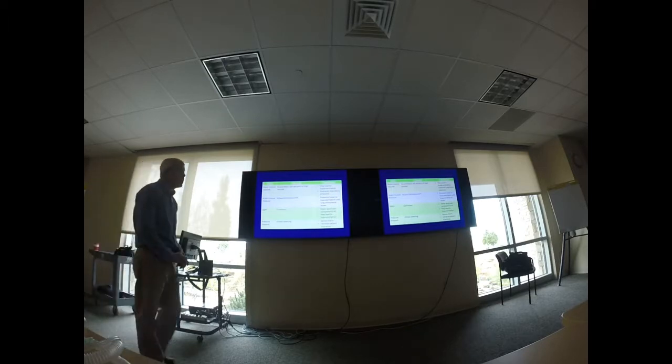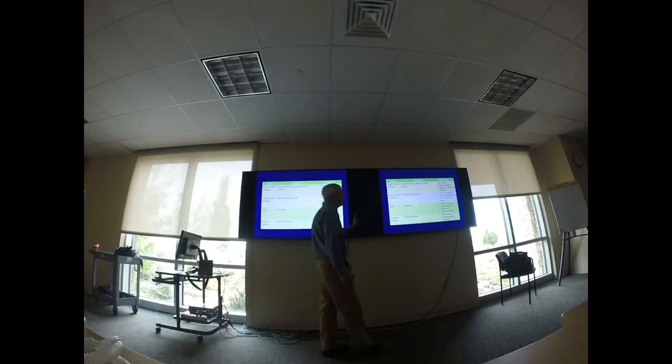So assist control volume guarantees a set delivery of the tidal volume. You know that every breath you're going to give with assist control, you're going to get in 500. Is that what you plugged into the ventilator? But because the patient gets 500 regardless, it might lead to some hyperventilation, right? Every breath he gets 500, I'm giving an increased minute ventilation, right? So I'm going to blow him off. Excessive inspiratory pressures you might see. Assist control pressure allows limitation of peak inspiratory pressure, but potential hyper or hypoventilation with lung compliance issues.